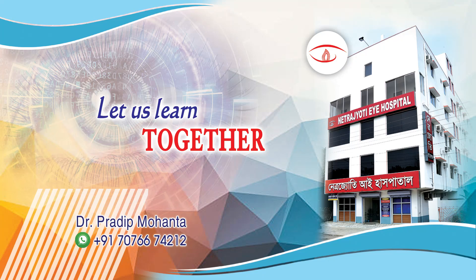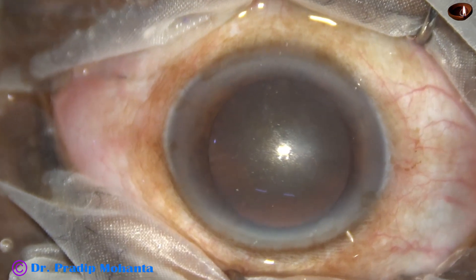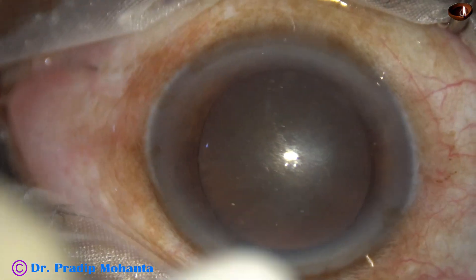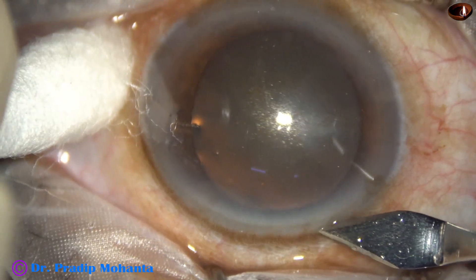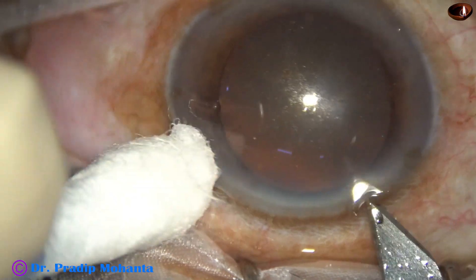Friends, welcome to my workplace at Rana Gha, West Bengal, India. This is a diabetic gummy cataract. The patient has been suffering from diabetes for eight years. Let us observe this surgery.